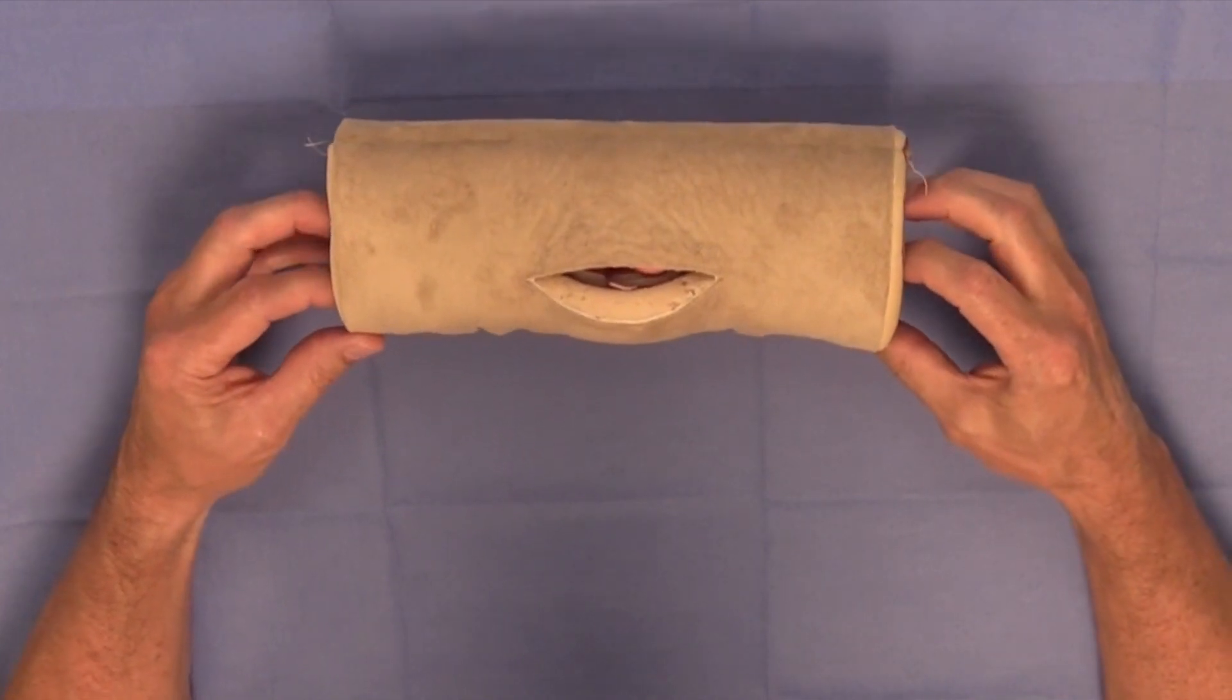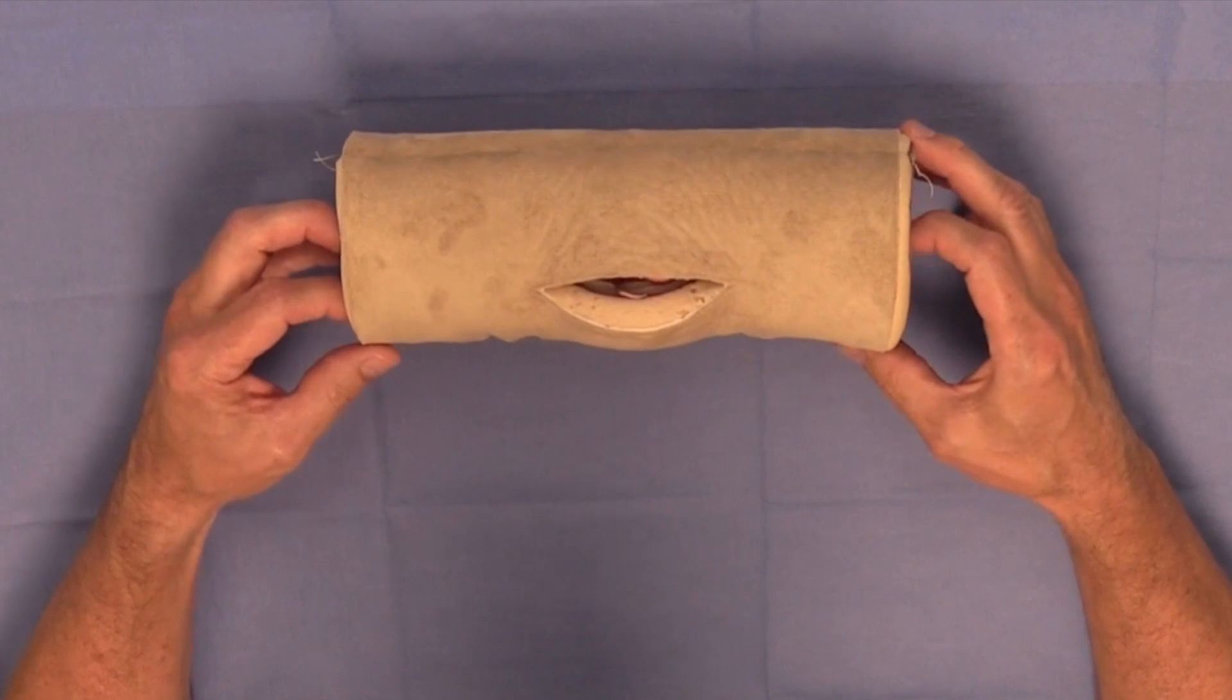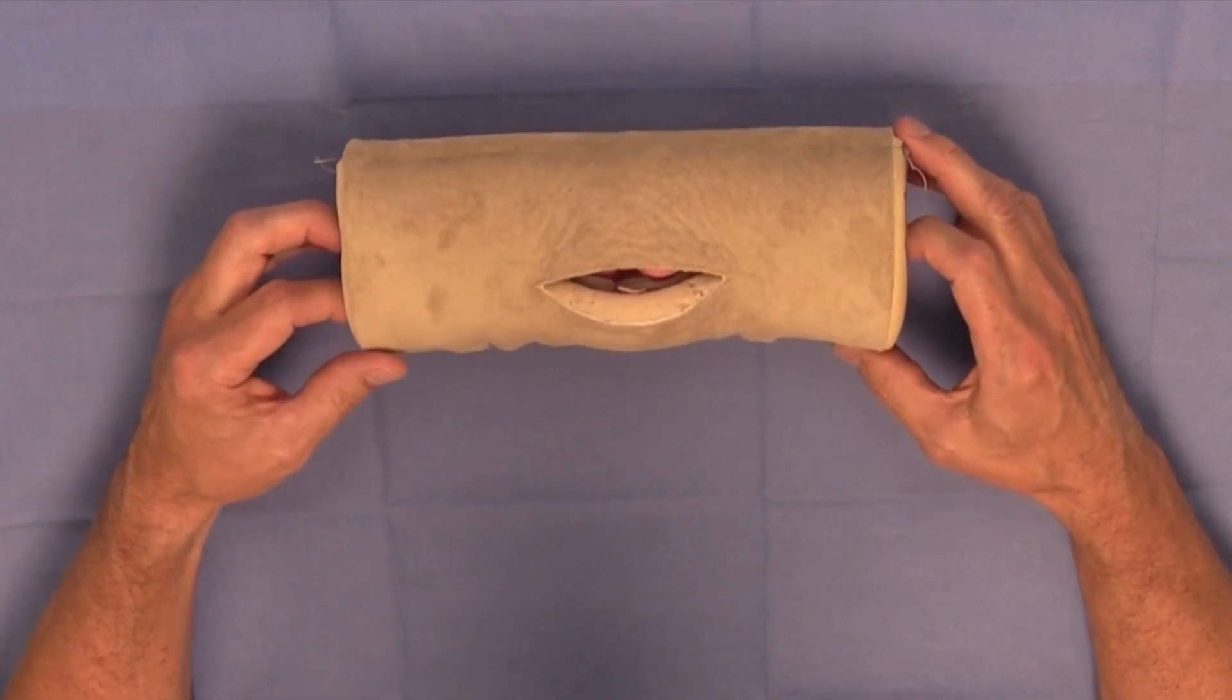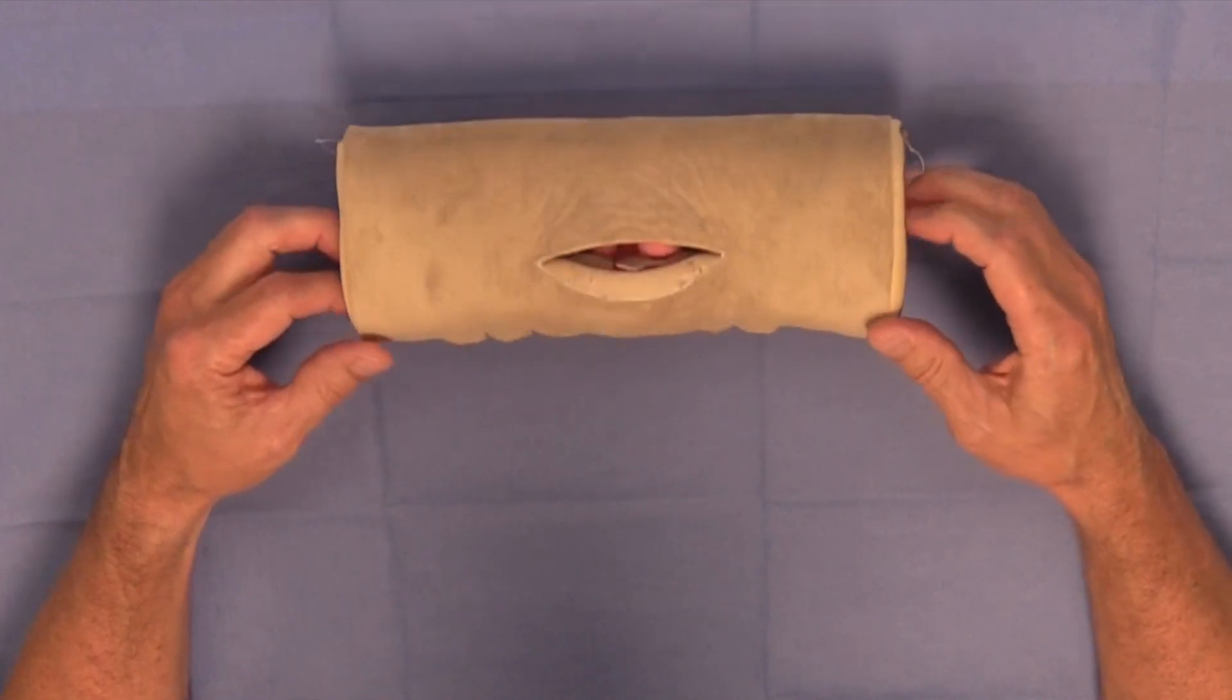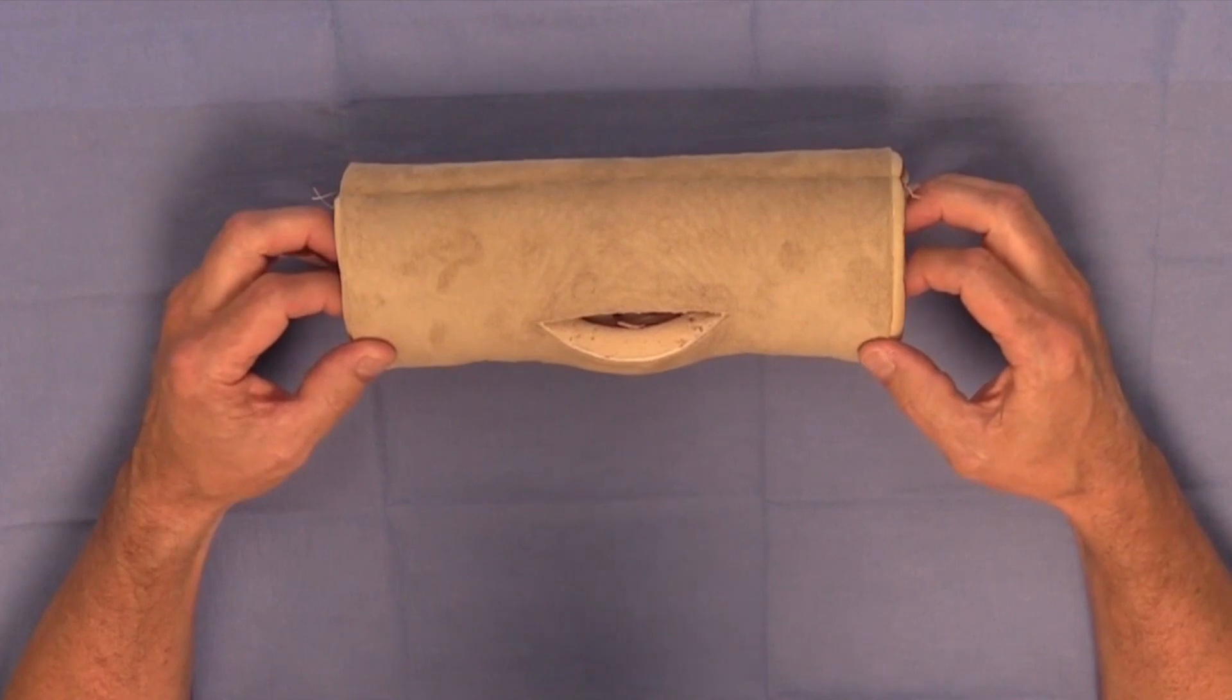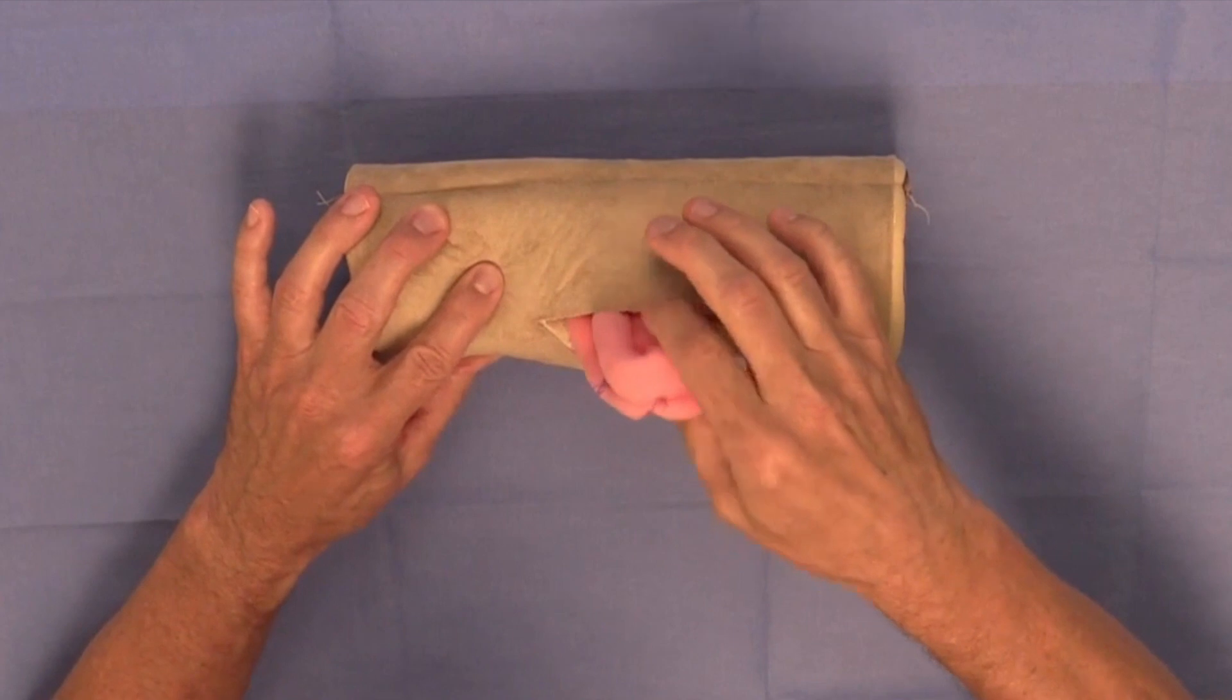Now the DAISY is an acronym for the dog abdominal surrogate for instructional exercises, and basically it was designed to mimic or be a facsimile of a ventral abdomen of a dog in which you could do the incision and take out a piece of bowel.